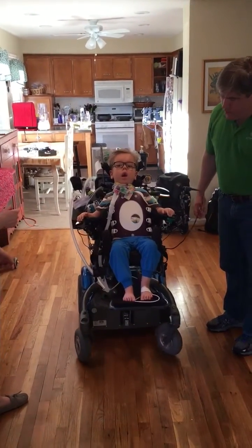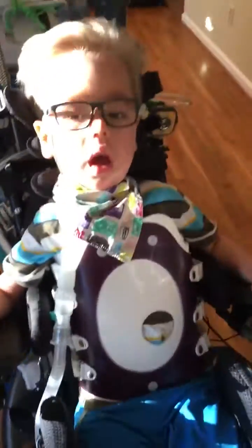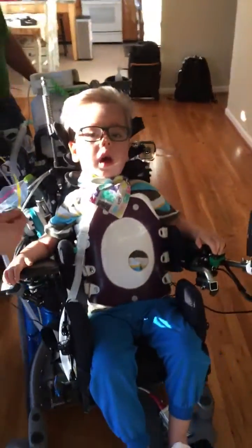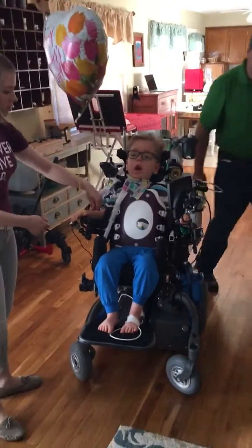I got both. Good. Look at that. Whoa! You got it. Way to go. You've got to move some more. That was the first goal.